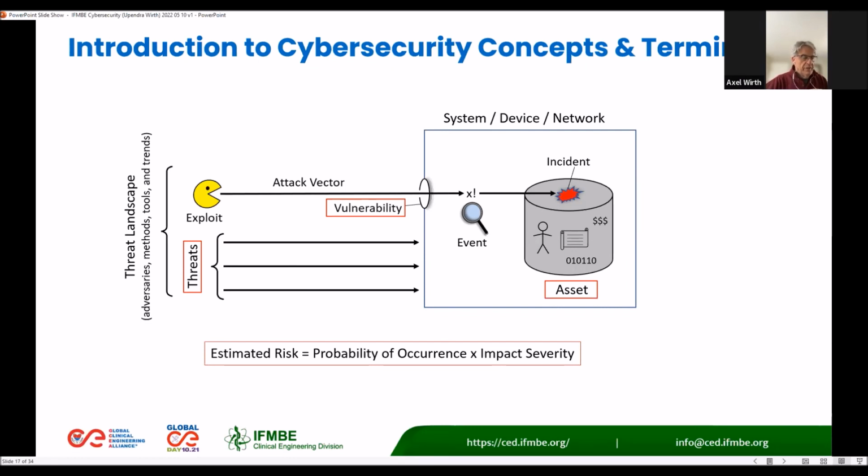And I don't want to get into details here. There are many methodologies that can be used to do so. But I think the key is that in cybersecurity, the term probability is very tricky because many times we really don't have historic data, right? If somebody writes a new piece of malware and releases it tomorrow, we have no statistical historic data about this piece of malware because it didn't exist before.